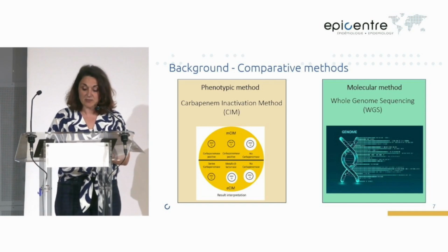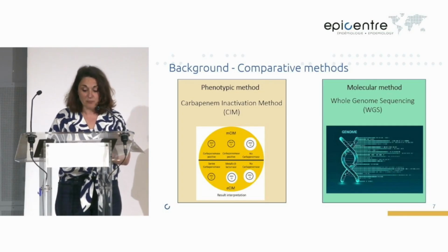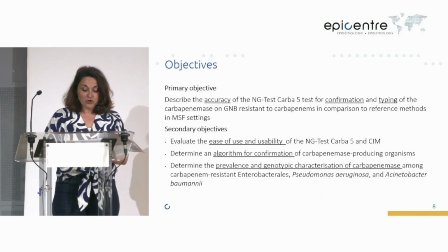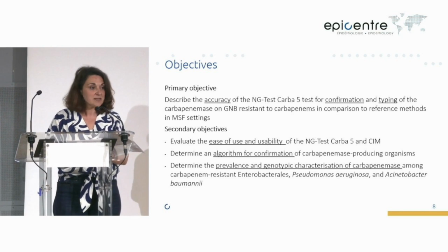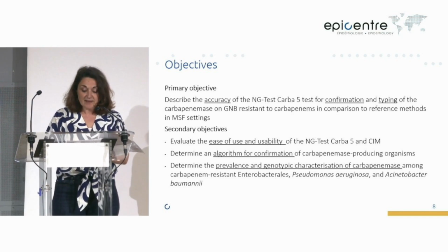It can be compared with the phenotypic method used specifically in MSF labs for this study, and it could be reused in the future. But it can also be compared with the molecular method, which is the gold standard. However, this whole genome sequencing method is very costly. So our objective is to assess the accuracy of the test to detect CPEs and compare it to reference methods.